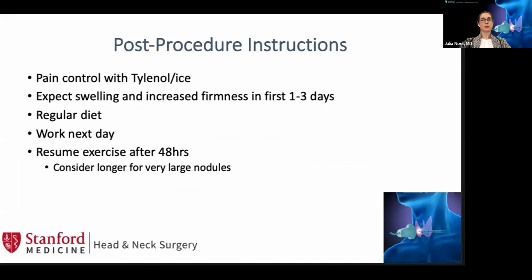And then briefly, some recommendations for postoperative care. If any pain medication is required, Tylenol is almost always sufficient, and many patients say they don't need anything after the ice pack on the ride home. We let them know to expect some swelling and increased firmness in the nodule for the first few days after the procedure, before the size starts to noticeably decrease. There are no restrictions on diet and very little downtime. Patients can work the next day, and in most cases resume full exercise after a couple days.